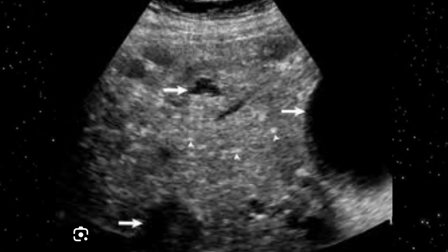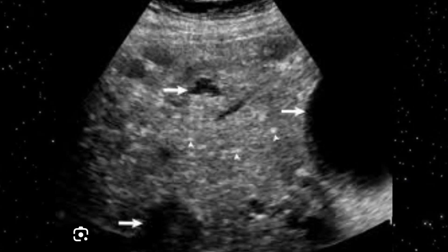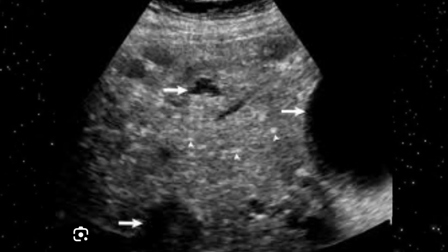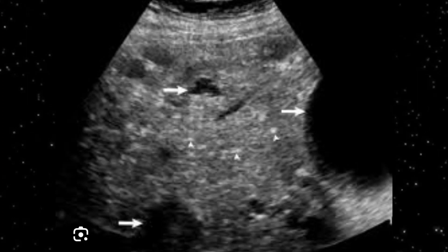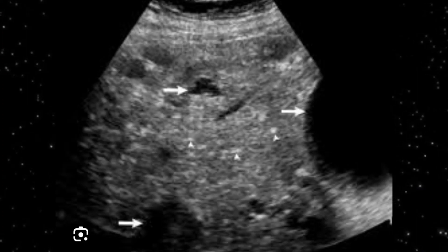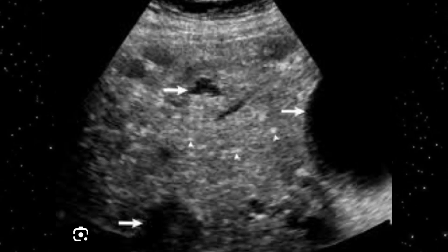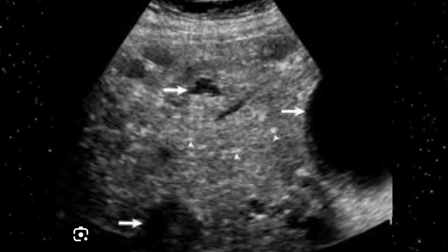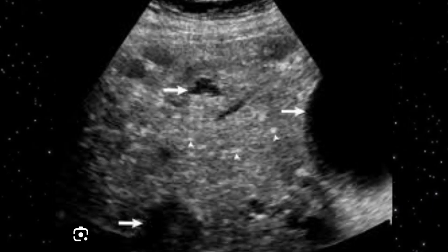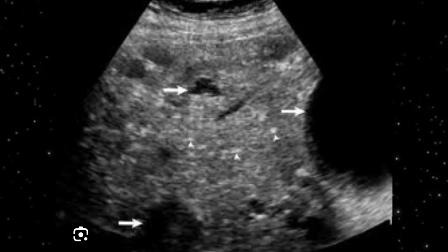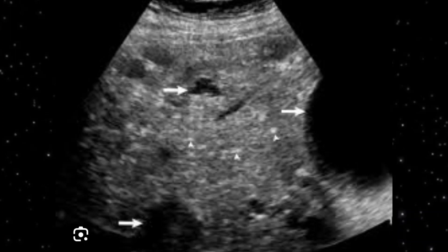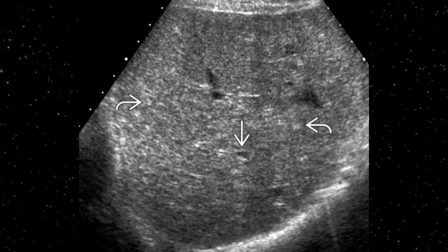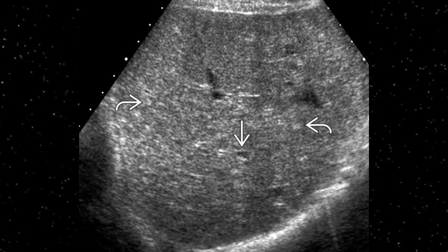One important point: metastatic deposits may also be cystic, especially in colonic cancer or cystadenocarcinoma of the ovaries. So cystic metastatic deposits are another possibility. Always put the differential on your report — first, this may be biliary hamartoma, and second, it might be metastatic deposits.